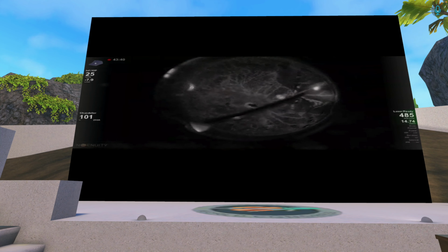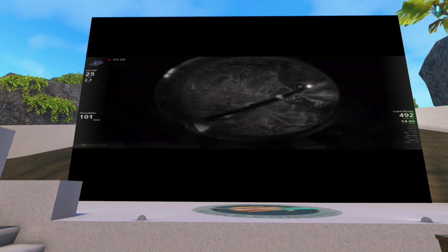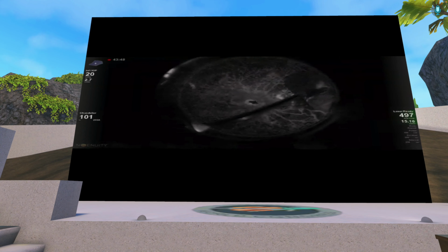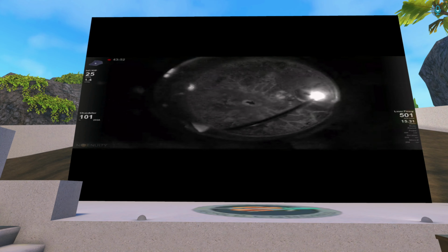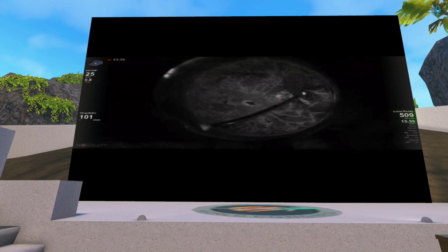I started with greenish, bluish filters and things like that, but I think they actually obscure the vascular picture, because here we need to focus on the vascular appearance, not the rest of the retina.